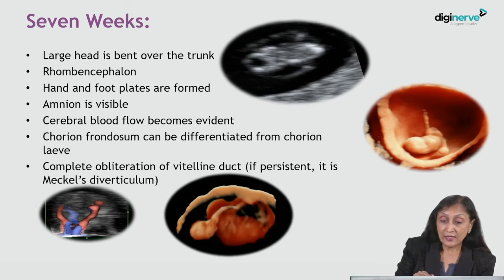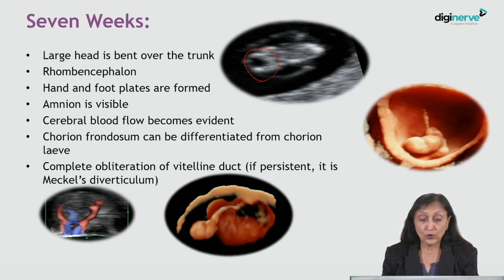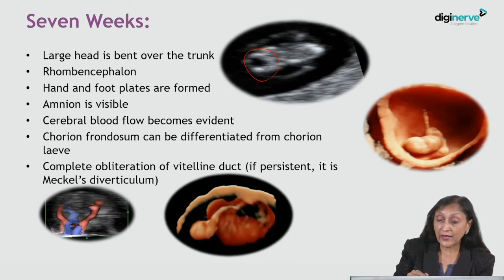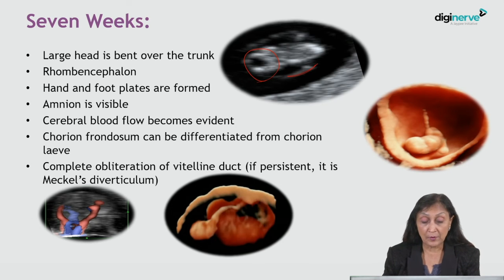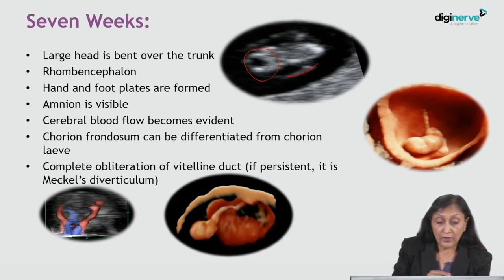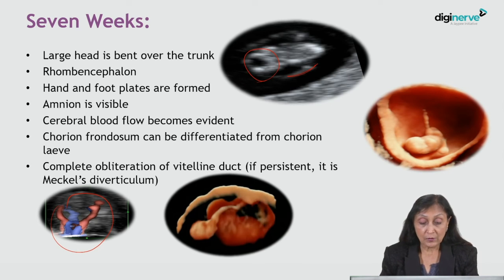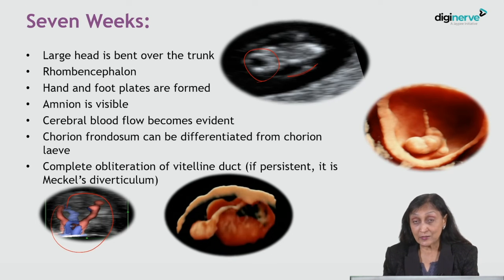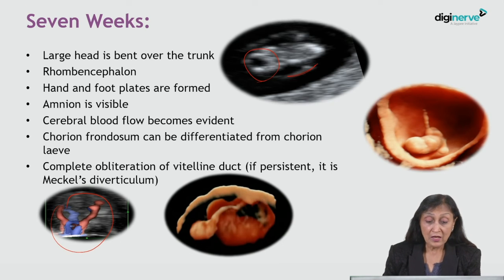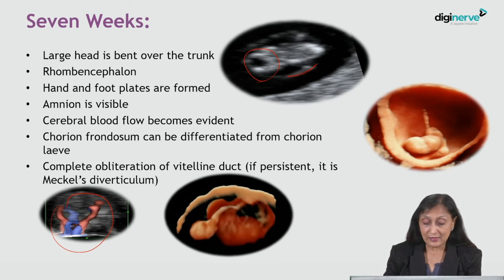At seven weeks, the head is large and bent over the trunk. You can see the rhombencephalon, and the hand and foot plates are formed. The amnion is visible as a faint round line around the embryo, and cerebral blood flow becomes evident. The chorion frondosum can be differentiated from the chorion laeve; it is the chorion laeve which ultimately disappears, while the chorion frondosum develops into the placenta. There is also complete obliteration of the vitelline duct, and if persistent, it may lead to Meckel's diverticulum in later life.